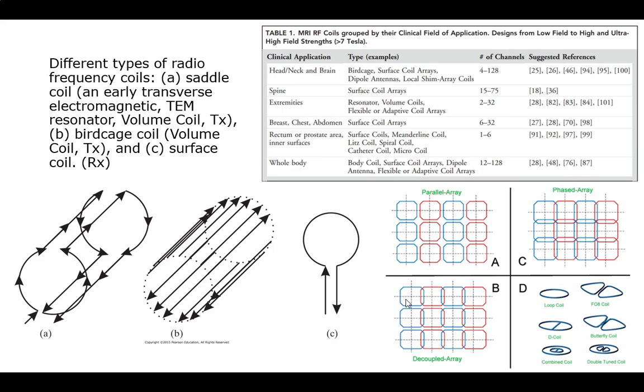Right. I have a question about the signal problems. Isn't all of our spatially differentiable information frequency encoded? So why do we care about? Because of inductance between the coils. Oh, I see. Okay. Yeah, one of the noise problems you're going to have is essentially crosstalk, right? You're going to get mutual inductance between them, and that can be pretty significant.